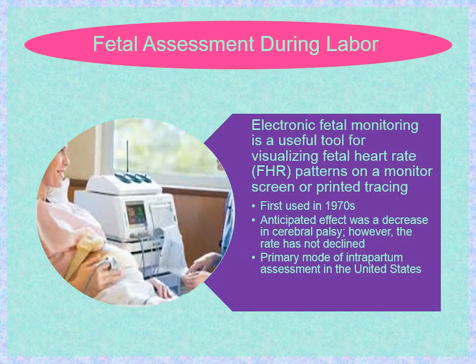Electronic fetal monitoring is a useful tool for visualizing fetal heart rate patterns on a monitor screen or printed tracing. It was first used in the 1970s. The anticipated effect was a decrease in cerebral palsy. However, the rate has not declined. The primary mode of intrapartum assessment in the United States is fetal monitoring.